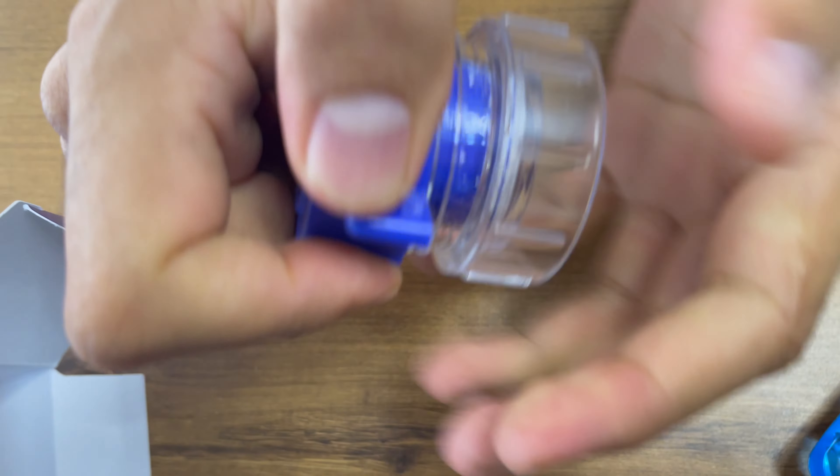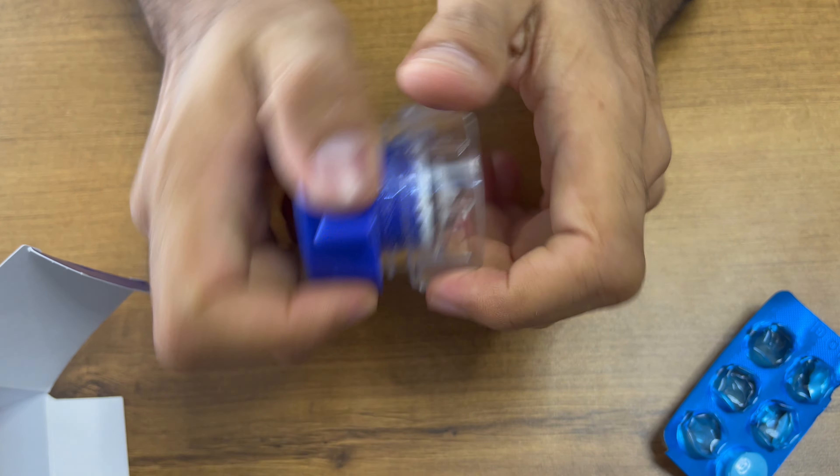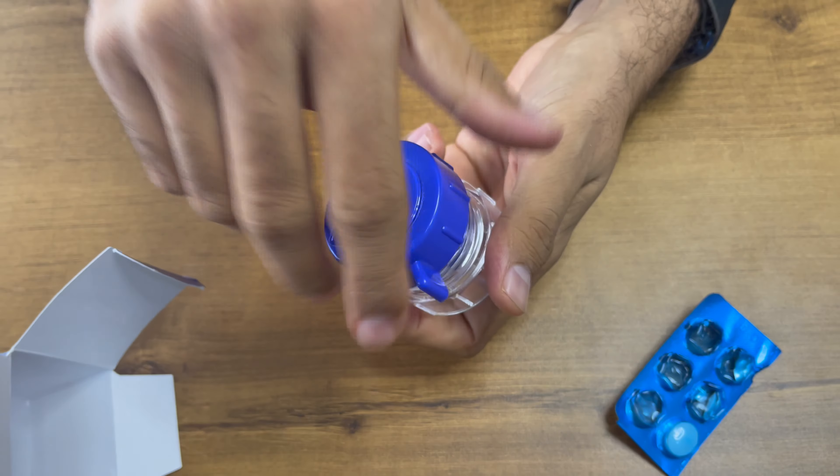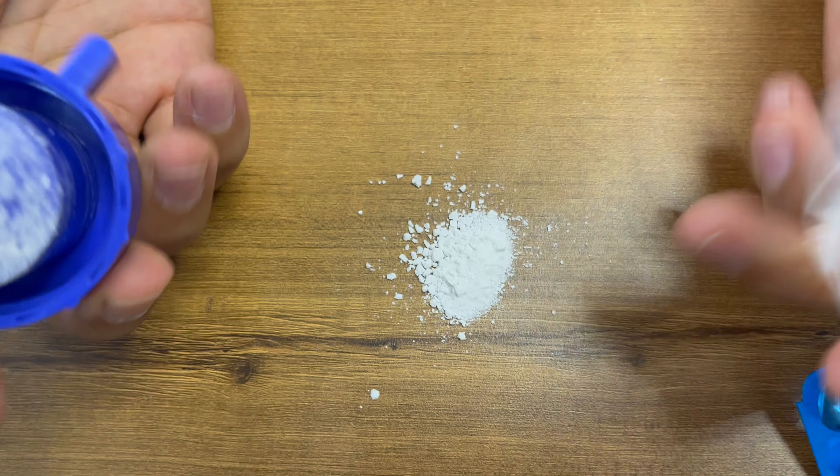Again, you have to do it like two to three times for better and more accurate powder form. You can see the entire tablet has converted into powder.